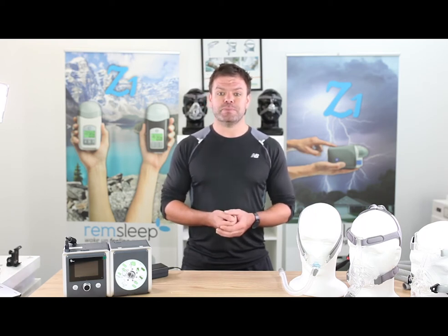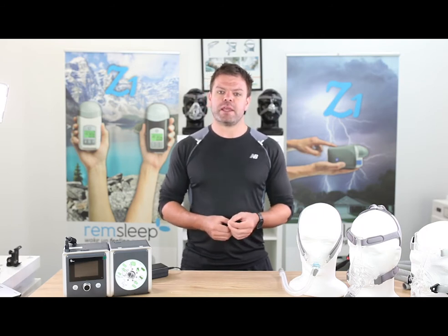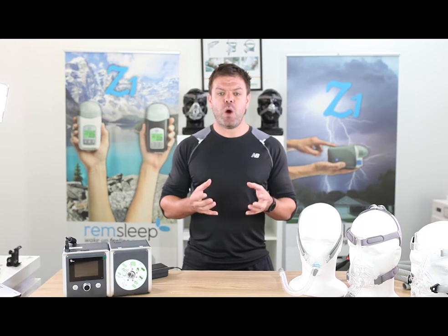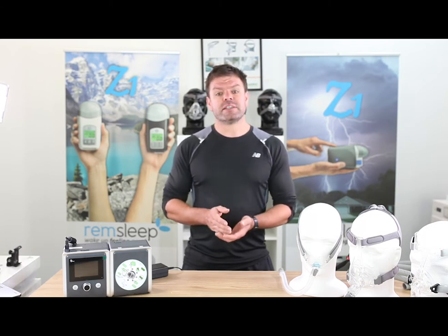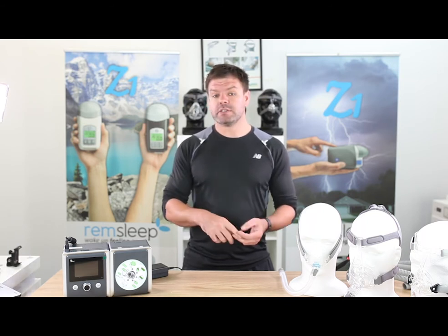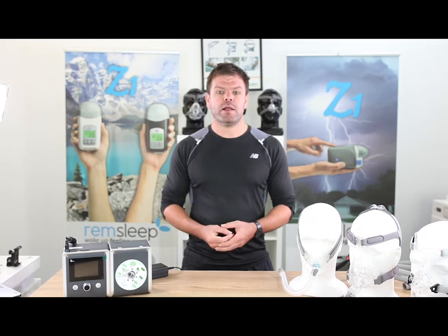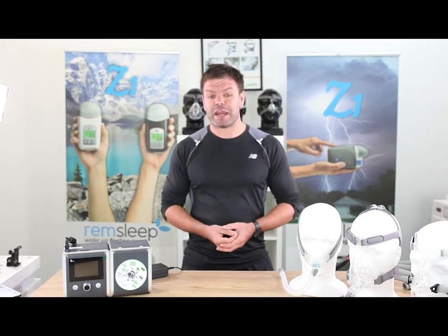However, the main thing to remember is just be persistent and keep using your therapy every night, as it does get easier with time. Another important variable is the AHI, or apnea-hypopnea index, which is a measure of how well your sleep apnea and snoring is controlled. Apnea-hypopnea index is how many events, whether it be apneas or hypopneas, you're having per hour, and ideally we would like this number to be less than 5, which is considered to be in a normal range.